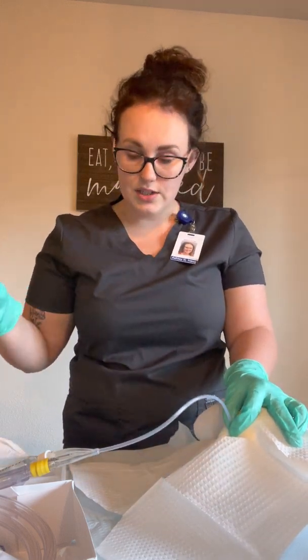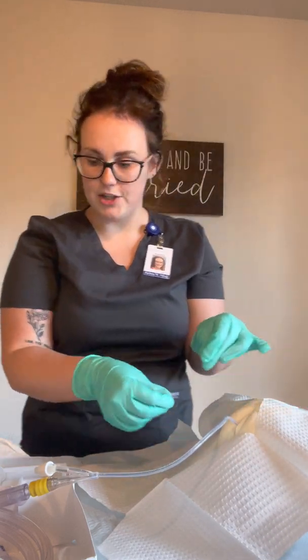And I'm going to hold on to the catheter with my non-dominant hand and inflate the balloon with my dominant hand. Okay, I've inflated the balloon, and now I am going to let go here, remove the syringe, and then I'm going to gently pull back until I feel resistance from the balloon. Now it's anchored into the bladder.